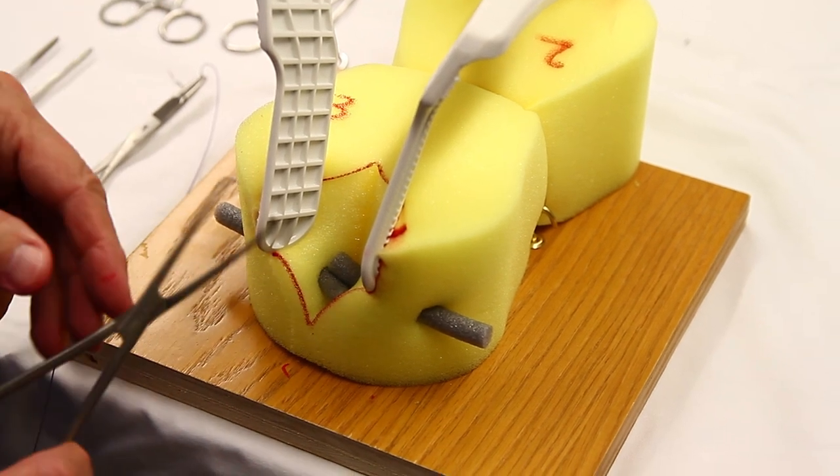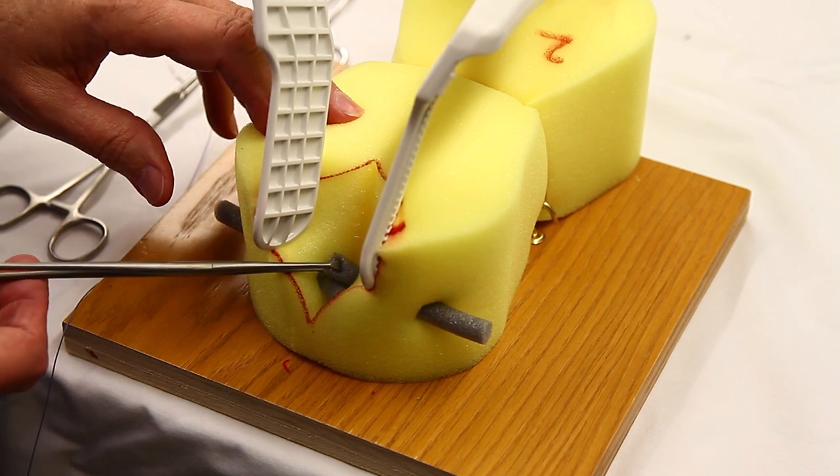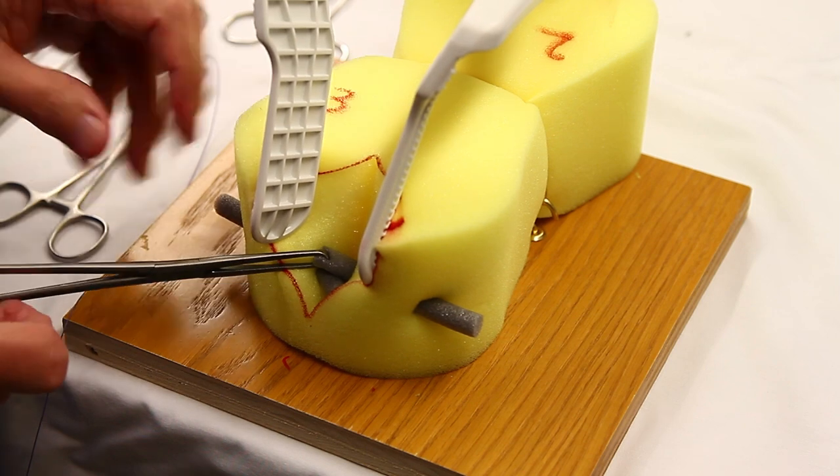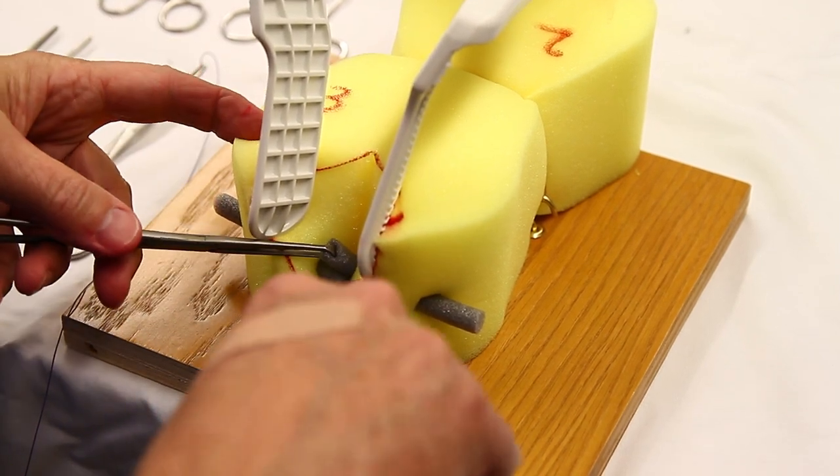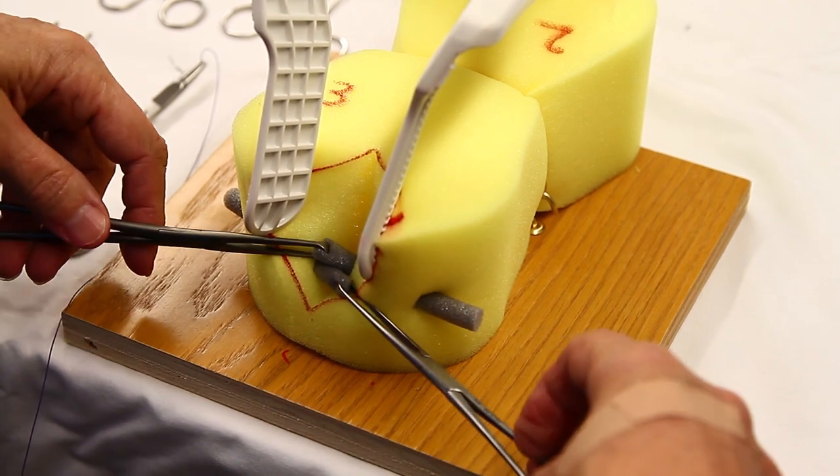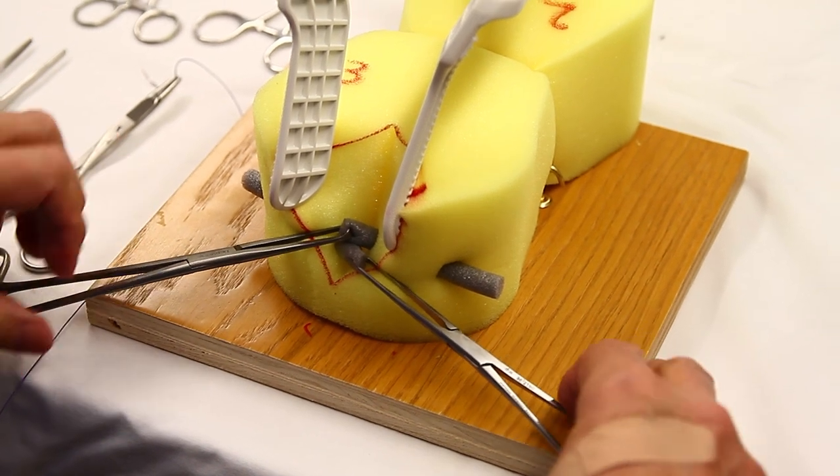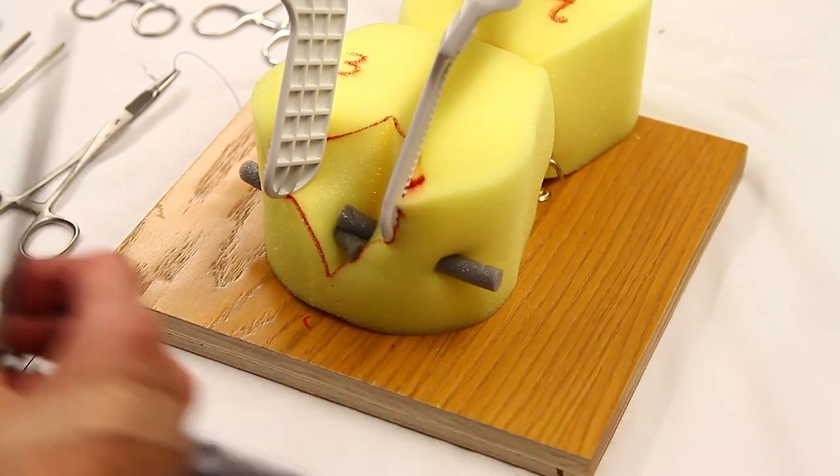The Alice retractor is very nice. It can grasp the sphincter and tug it out into view. It's nice to have two of them so you can grasp the opposite one and tug them crisscross like that. An assistant, if you have one, may hold those for you or once they are in easy view, sometimes you can let go of them and they'll stay put.